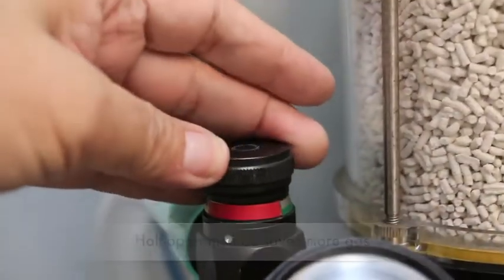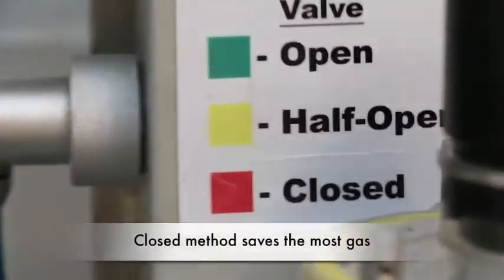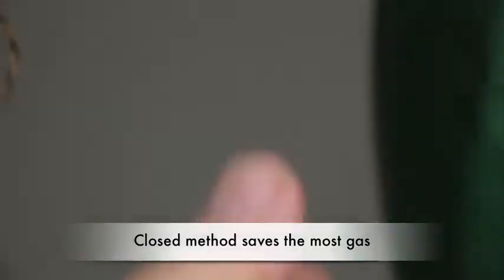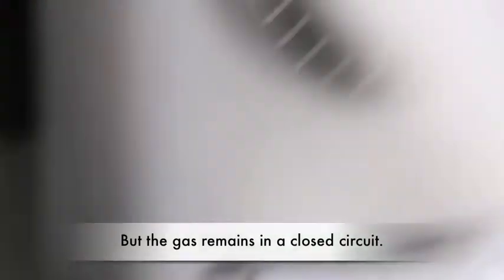And then the closed method. The closed method is where the vet must be very skillful and very alert, because the closed method means the gas will be still inside here, the bag, and it goes down in the circuit without escaping to the scavenger.